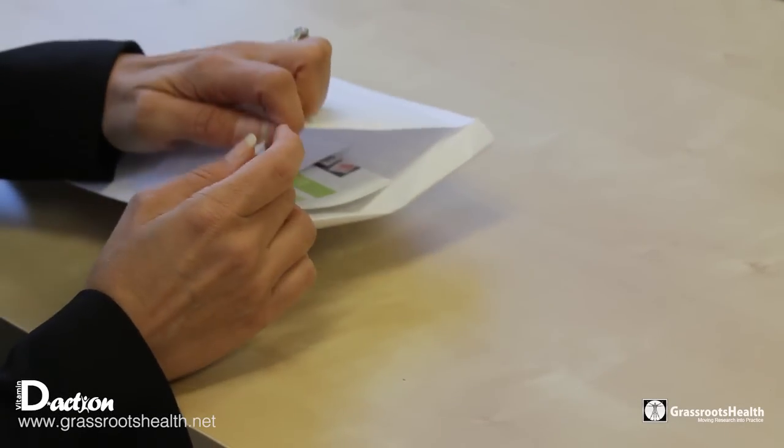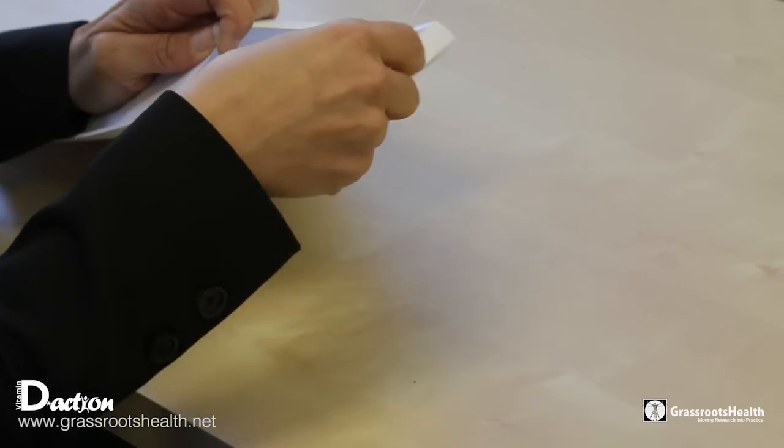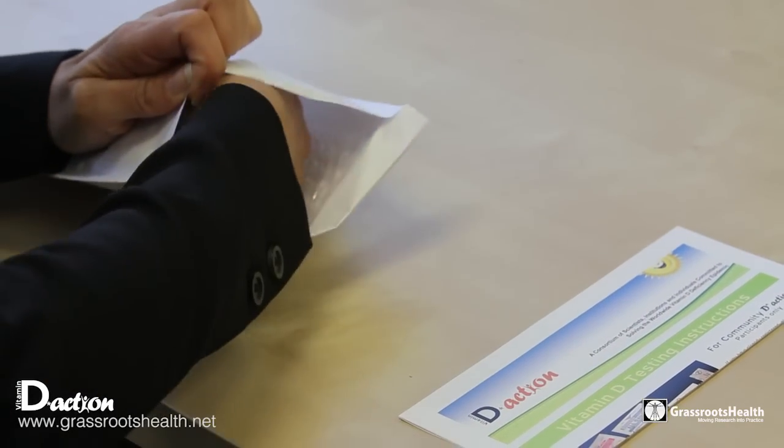This is a video to help you see how to do your best blood spot card for the Vitamin D Action Project.